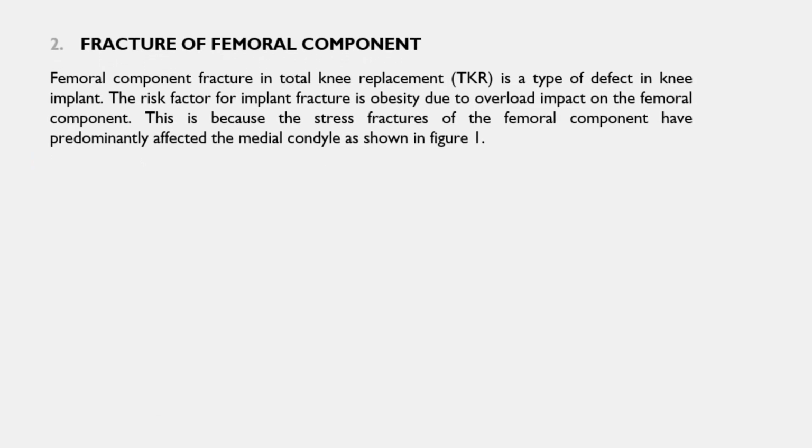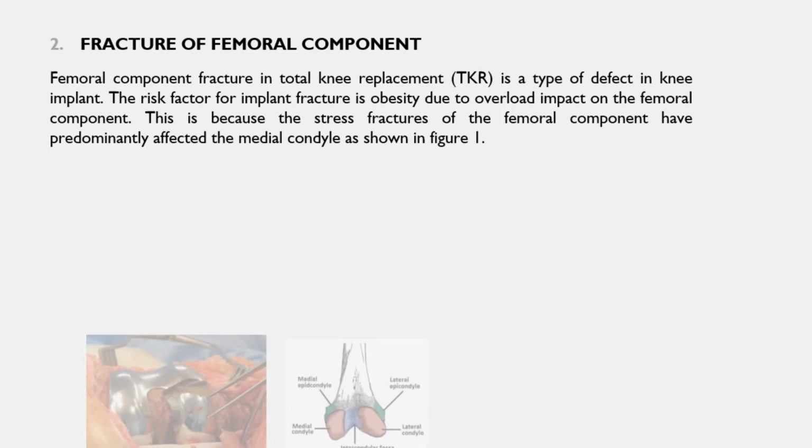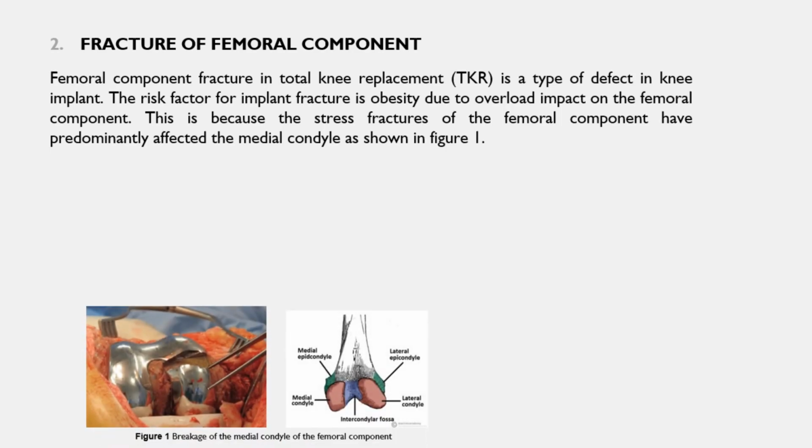Secondly, fractures of the femoral component. Fractures of the femoral component are one type of defect in the implant. The risk factor of fractures is obesity due to overload impact on the femoral component. This is because stress fractures of the femoral component have predominantly affected the medial condyle, as shown in figure 1. Figure 1 shows the breakage of the medial condyle of the femoral component.